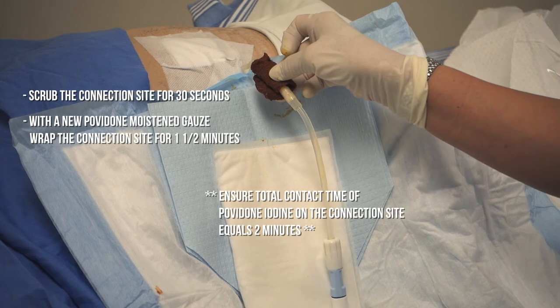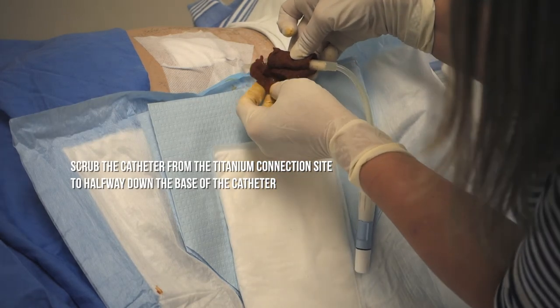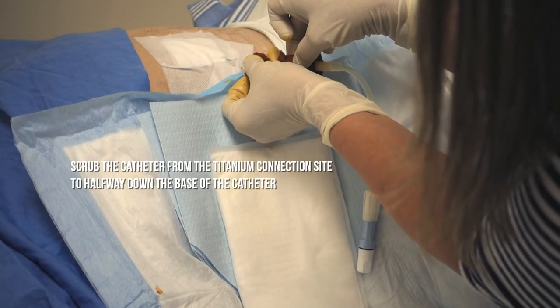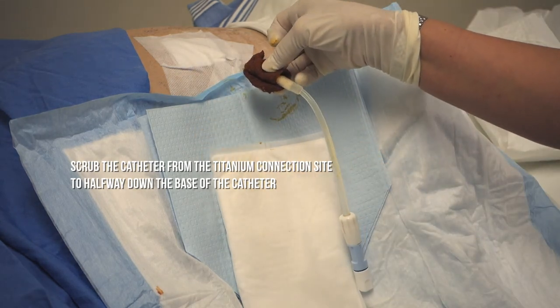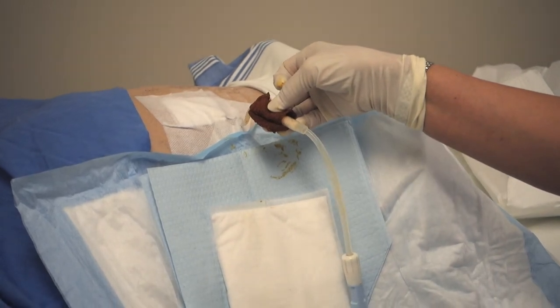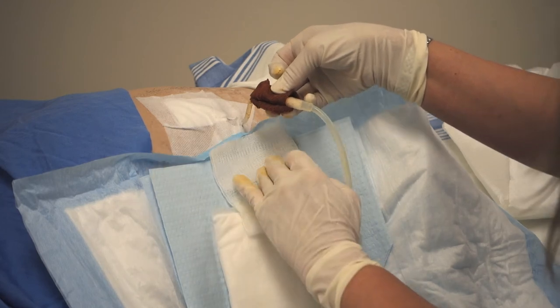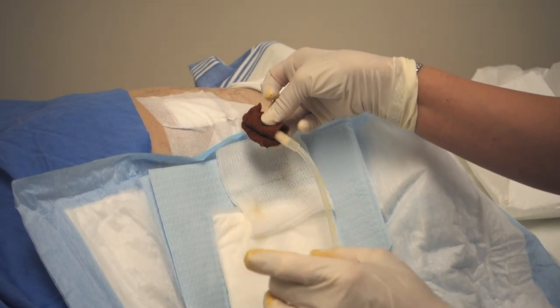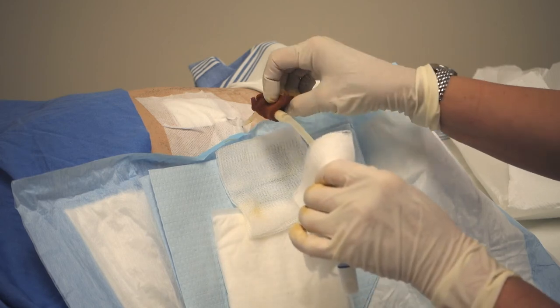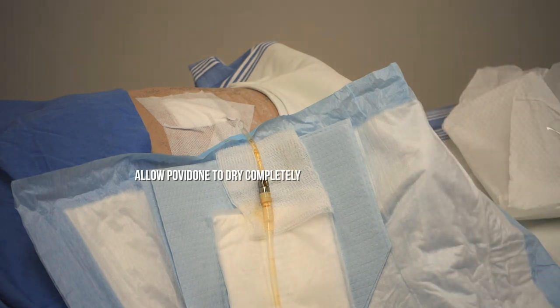Then you will take another gauze moistened with povidone iodine and you will scrub from the titanium to halfway down to the base of the catheter. Then you will take a sterile gauze and place it underneath the connection.